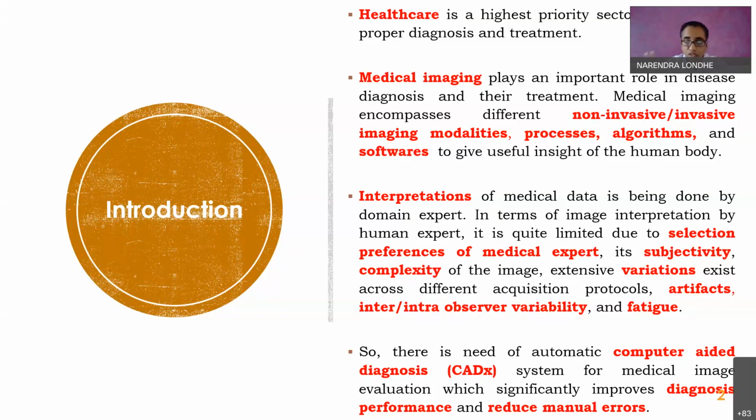If you see the present scenario, it is somewhat manual, means the doctors, radiologists analyze the images. Okay, and if there is some computer assistance, that assistance is just to make the radiologist able to see in detail, making the 3D images, or giving some 3D structures, giving an area in centimeters and other things. That facility is there with the software and the programs that have been embedded in those machines.